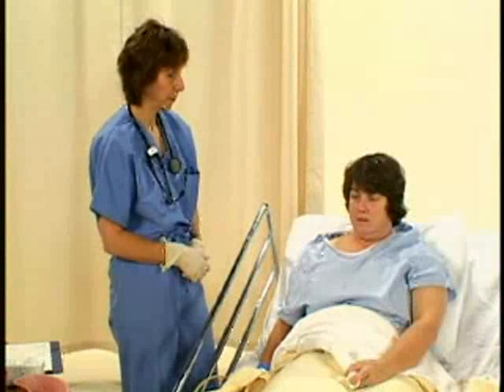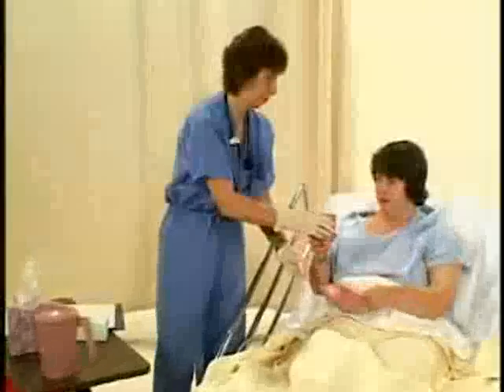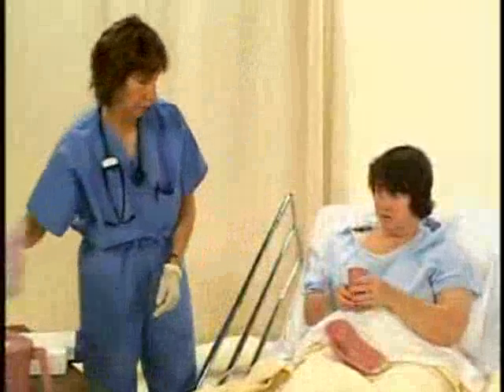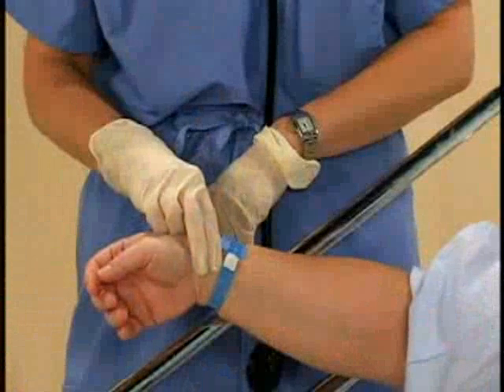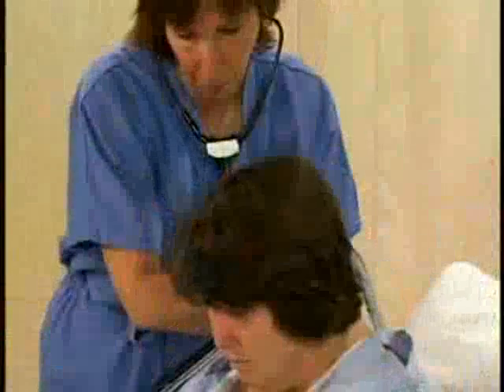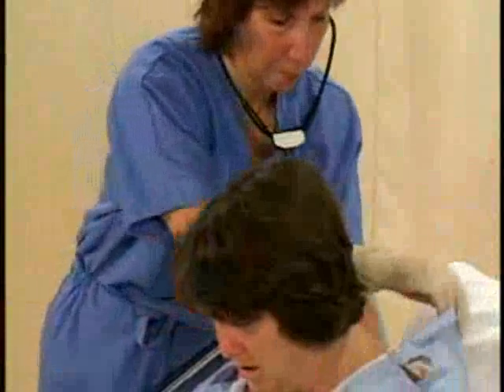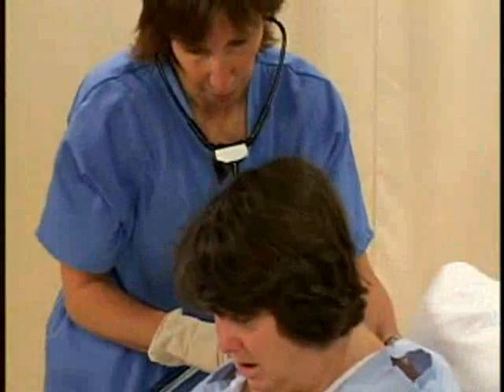If the client is supposed to take more than one puff of the inhaler, have the client wait at least 60 seconds between each prescribed puff of medication. After the treatment, offer the client a mouth rinse with warm water or saline. Observe the client for several minutes to assess for any possible adverse effects from the medication. Inhaler medication is delivered into the bloodstream almost immediately, and reactions can occur very quickly.